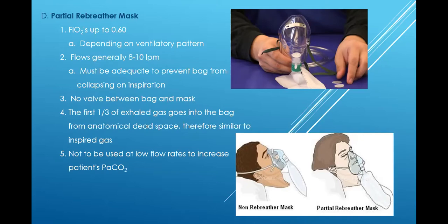Depending on what flow I put it on, it must be adequate enough to prevent the bag from collapsing on inspiration. Okay, I have to keep the bag from collapsing on inspiration. So let's get out the partial rebreather. And let's show you that.